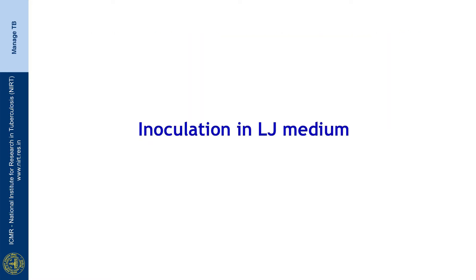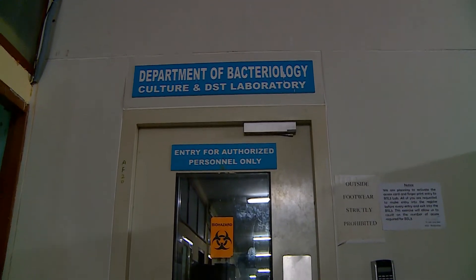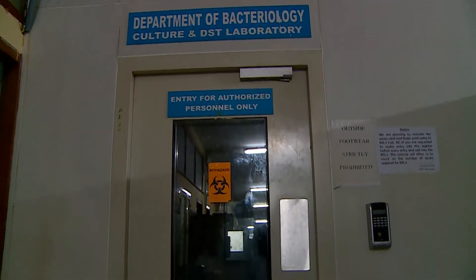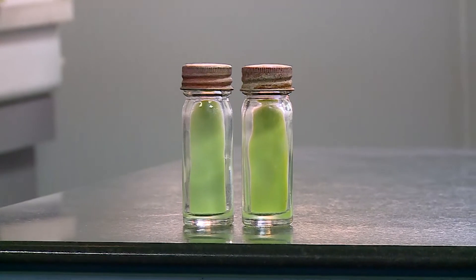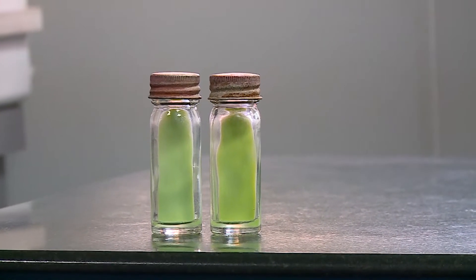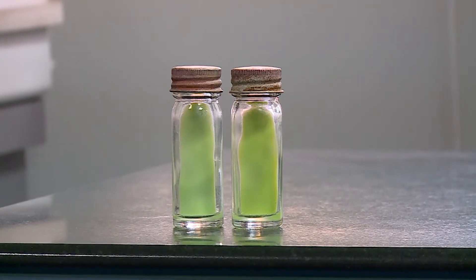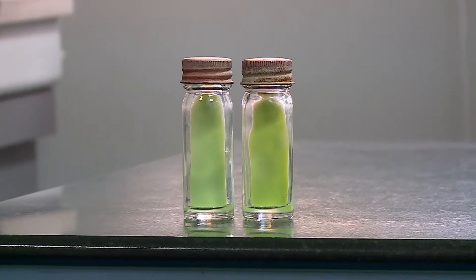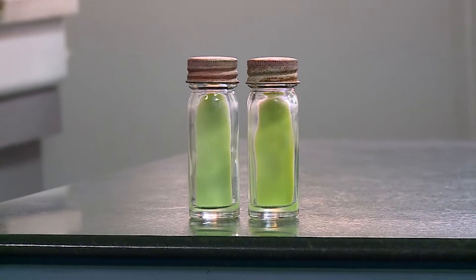We will now see how the LJ medium is inoculated with the processed sputum deposit. This is how the plain LJ medium looks, onto which we are going to inoculate the processed sputum deposit. It has a little water of condensation at the bottom, which provides moisture for the growth of the organism.